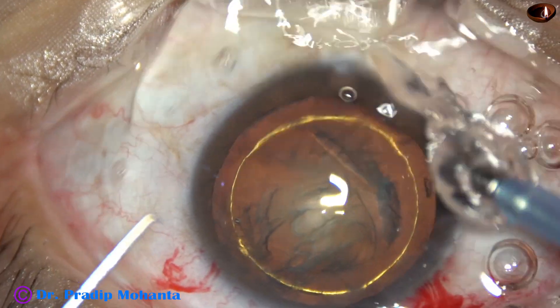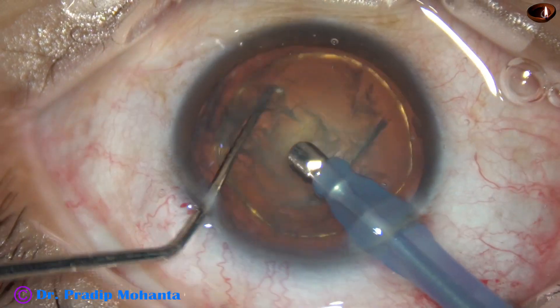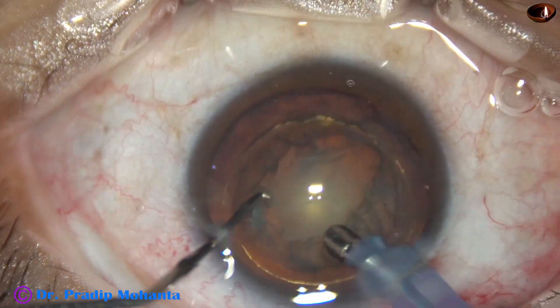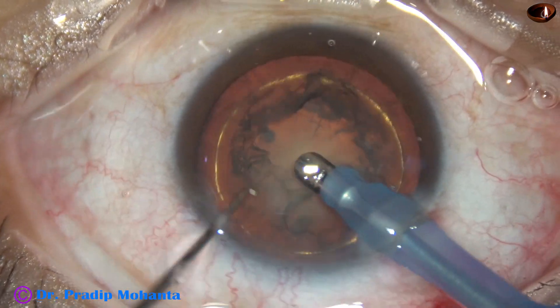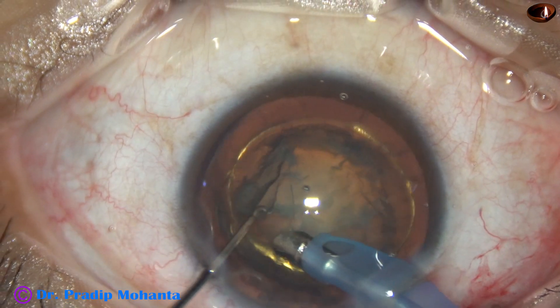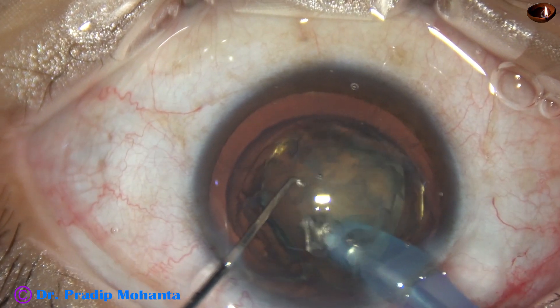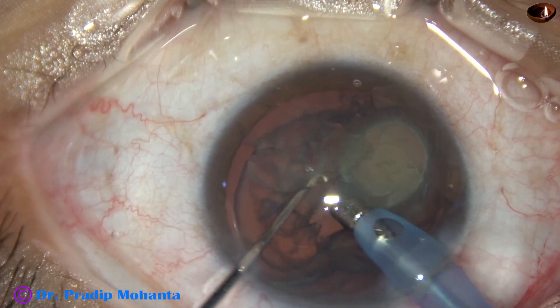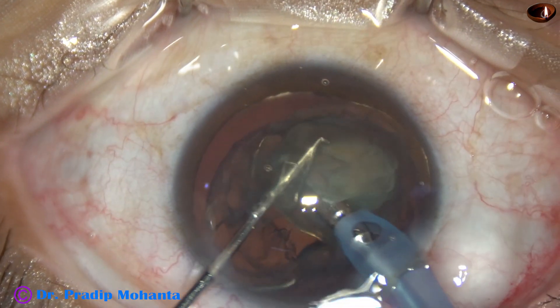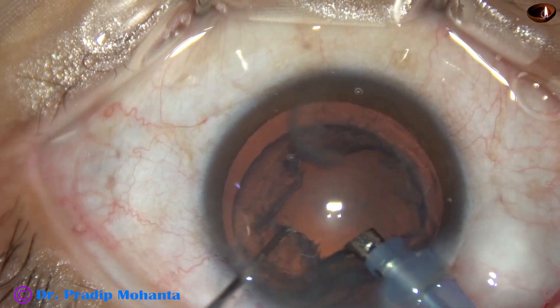In the carousel technique, we just rotate the nucleus nicely, remove some superficial cortical lens matter, and then place the tip of the phaco needle at the edge of the nucleus and let the nucleus rotate, and it gradually gets emulsified and vanishes within a few seconds.